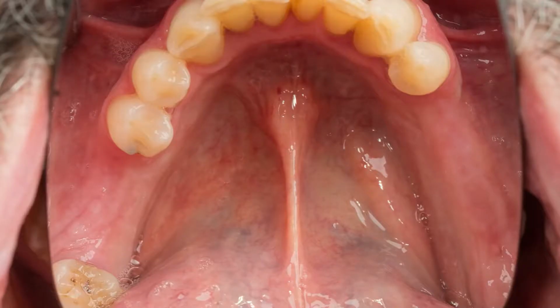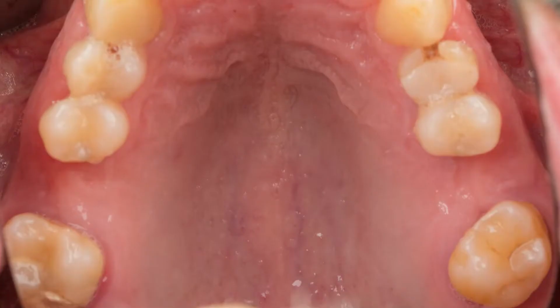You see, my dad does not like dentists one bit, so I wanted a system that could be very reliable and, of course, minimally invasive. You can see that we have nice keratinized soft tissue, plenty of bone available, a deep vestibulum. So apparently we have no real need for soft tissue management, meaning we don't need to raise the flap. If we did, we could reposition the keratinized tissue or perform a vestibulum deepening procedure, such as vestibuloplasty or free gingival graft.